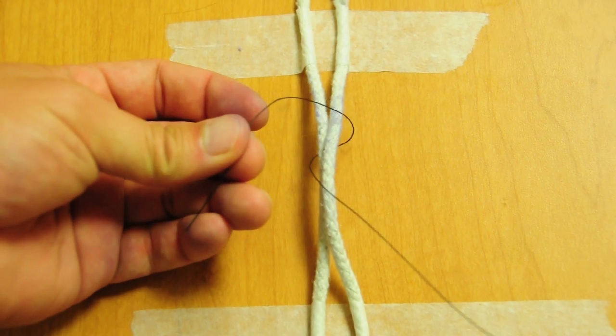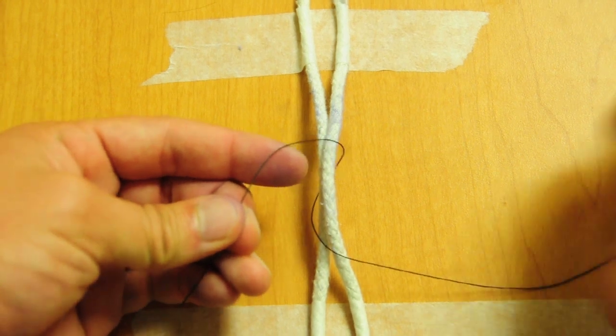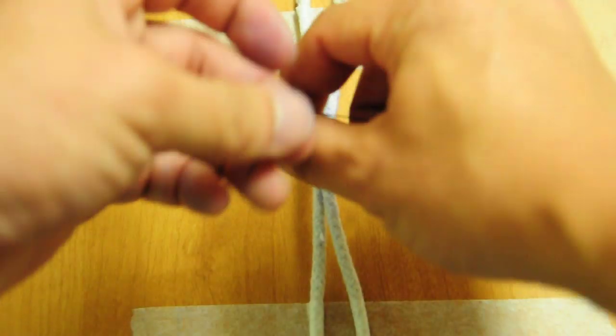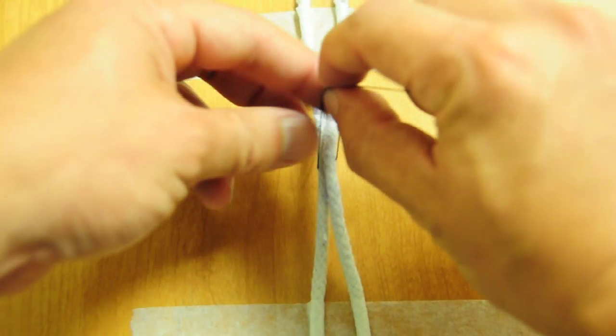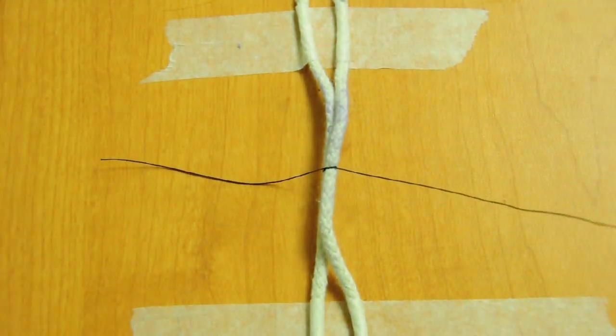So I'm going to start out. This is above. So you got to either tie your surgeon's knot two-handed, because you can't tie a one-handed surgeon's knot.